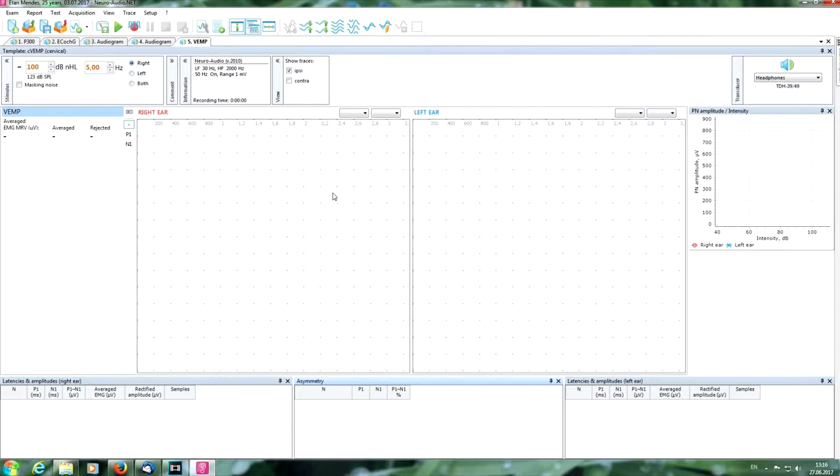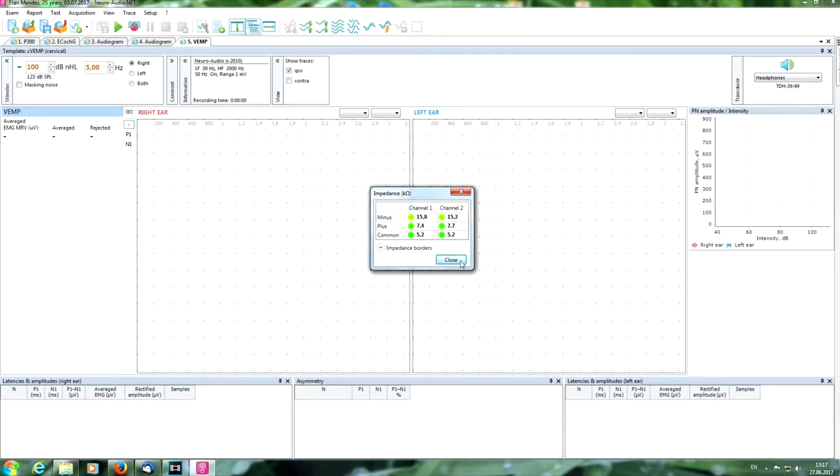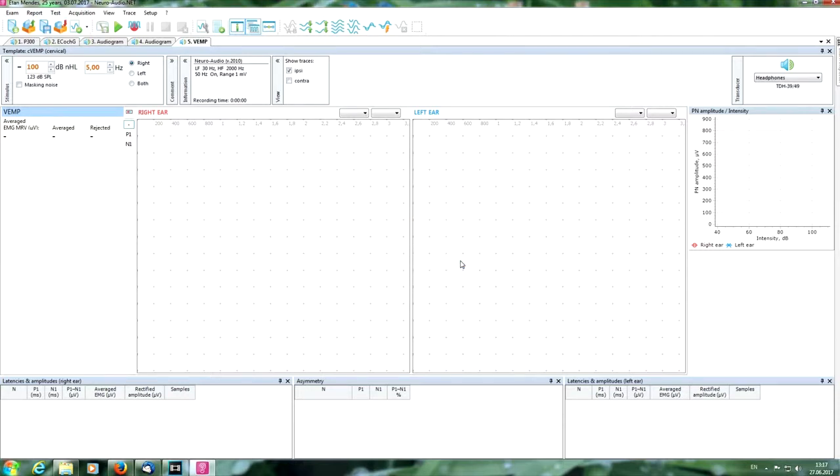Now we put electrodes and we need to check the impedance. Here we can see that we can make it better, for example by moisturizing the electrodes or by preparing the skin. We can see it online. If it is okay, press here.